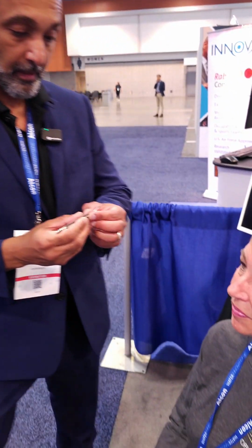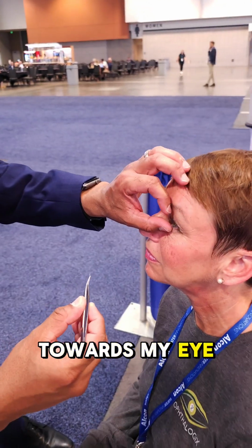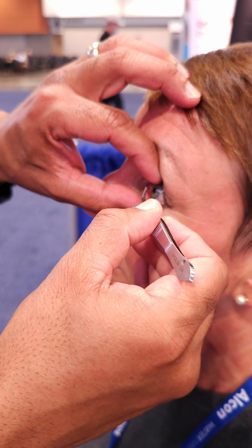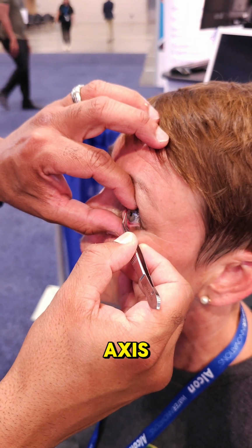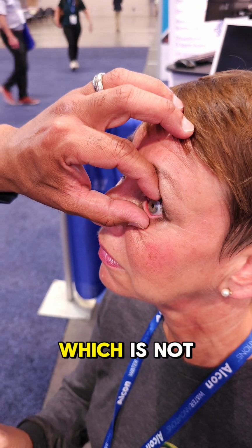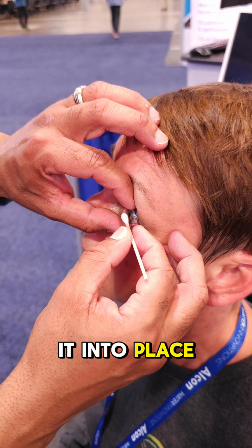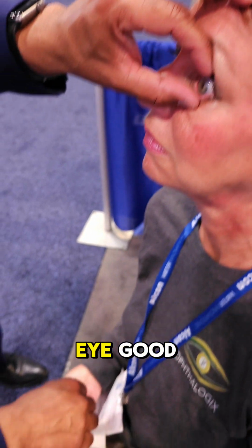All right. So she's going to look towards my eye, right here towards my eye. I'm going to not let her blink. I'm going to place this neatly over the area of the defect, which for our purpose is going to be slightly superior of central, slightly superior to our visual axis. It'll slide around because I'm placing it on top of a contact lens, which is not what I would normally do. I'm going to take my rounded ophthalmic sponge and gently press and roll it into place a bit to make sure that I have 100% surface contact with the surface of the eye. Good.